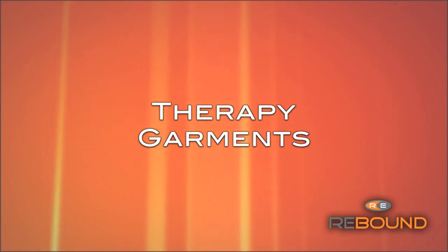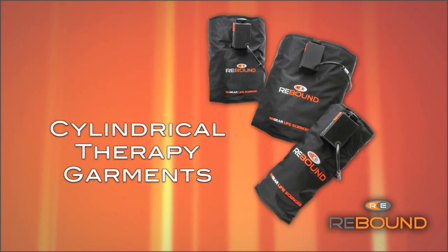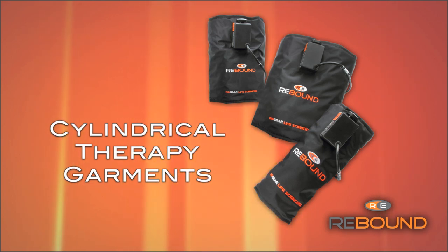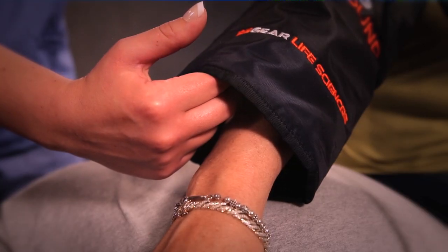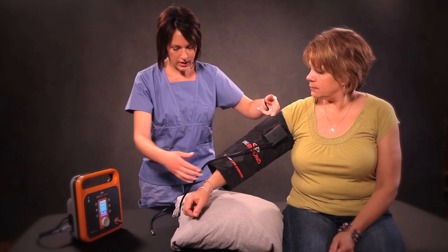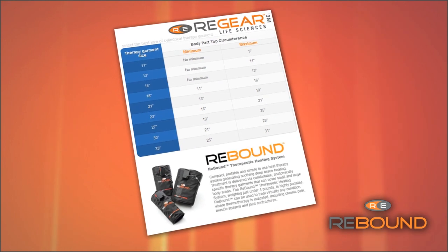There are three types of therapy garments to choose from: cylindrical, back, and shoulder. Cylindrical therapy garments provide circumferential heating and are ideal for treating the limbs. To use, select the best fitting garment and slide it onto the patient. A properly fitting garment should not be too tight or too loose. We recommend a minimum of a quarter inch up to approximately two inches of space on each side of the limb. Refer to the garment sizing chart for acceptable size ranges.